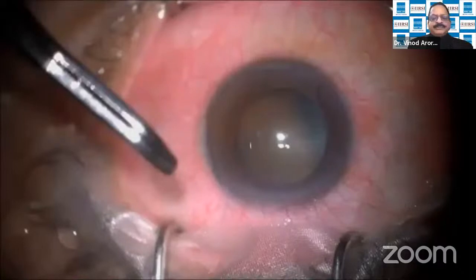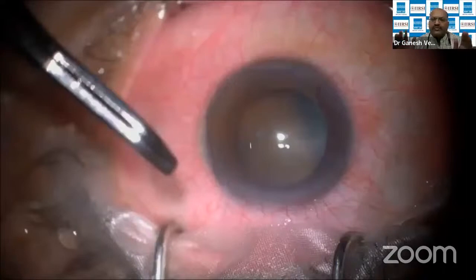I think iridectomy is very important, mainly because if your chamber becomes too shallow, the iris will go and plug the ostium. If you have seen eyes which had a shallowing chamber, and you see them postoperatively, say 1 or 2 years later, you'll find that the iris has stuck to the ostium, but the filter still works. The ostium is patent and IOP is still low, but you know that a long time back there was a shallowing of the chamber and the iris got stuck to the freshly cut structure. So iridectomy is very important, even though you may have a complication in the immediate postoperative period; later on, the filter can continue to function. It's mandatory for most cases.